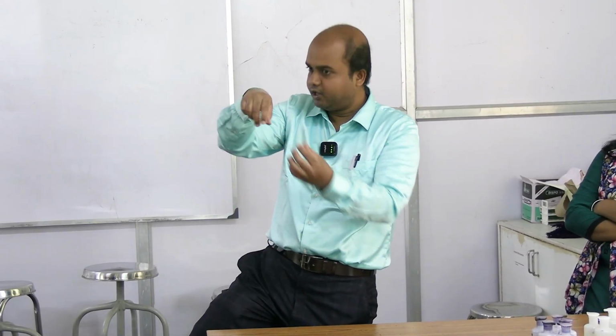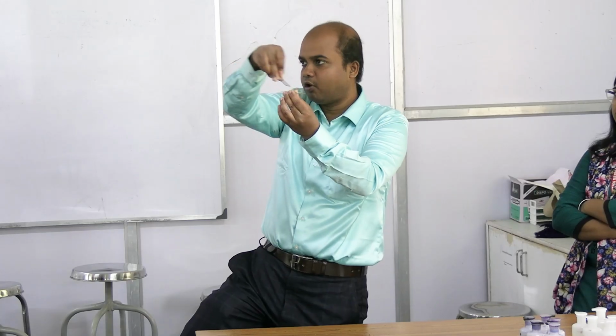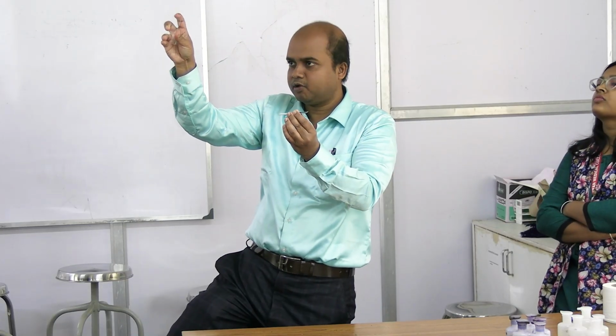And another slide, this now will be the spreader slide. Another slide is taken, and just for showing you, you do it keeping it on a horizontal surface. Don't hold it up. You keep the slide somewhat in front of the blood drop. Now draw it backwards so that this edge comes over the drop of blood, and allow the blood drop to spread.